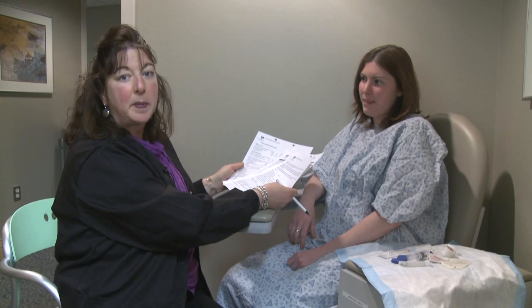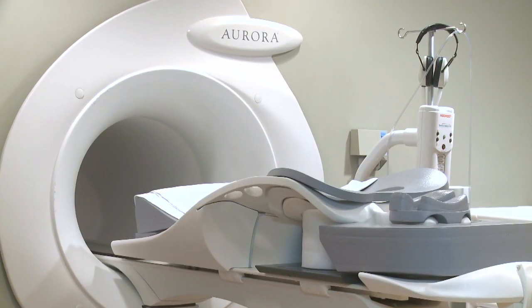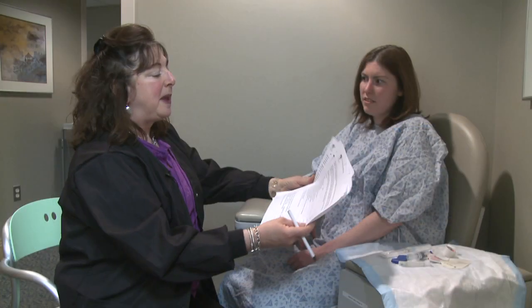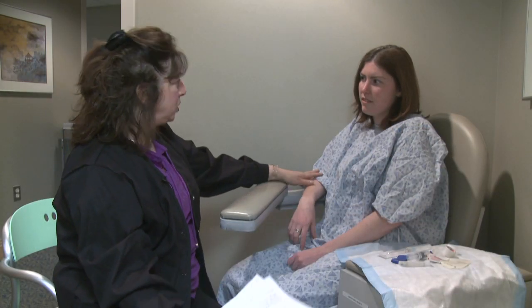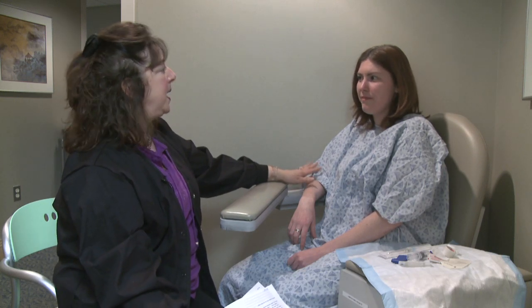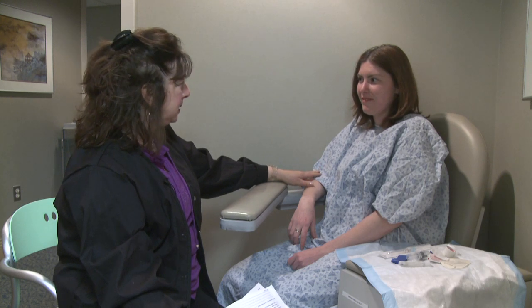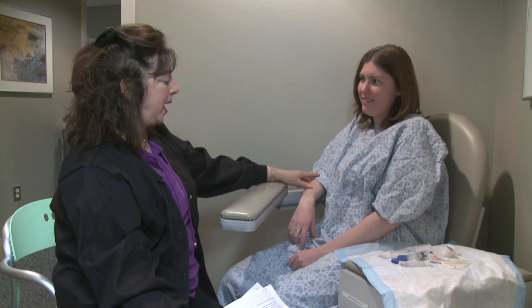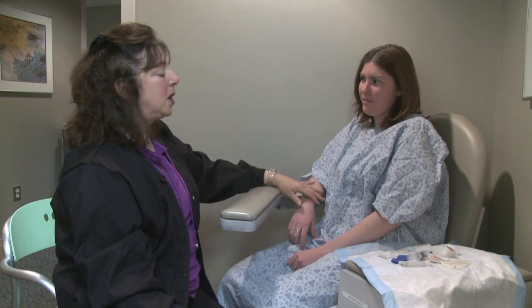We have to ask the patient these questions to make sure that they're able to go into the magnet to have their breast MRI. And I'm asking her questions such as, is there any chance that you are pregnant? No. Do you have any metal in your body? No. A pacemaker? Brain aneurysm clip? No. Have you ever had any surgery on your breast? No, I haven't.